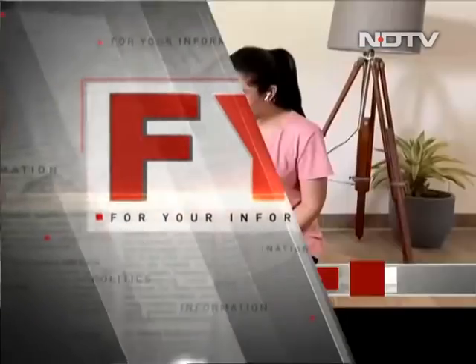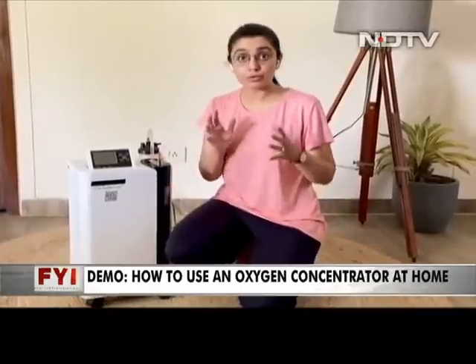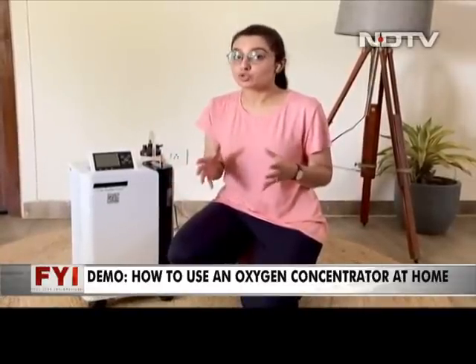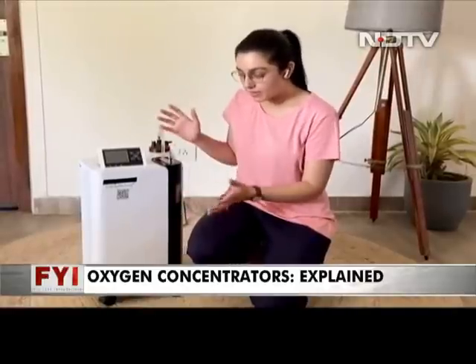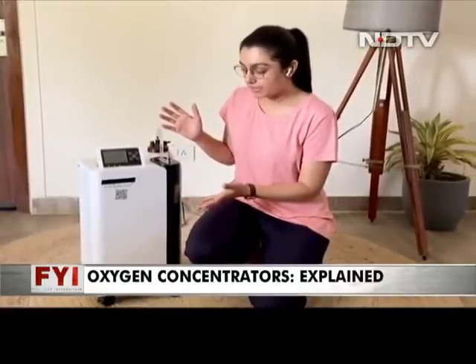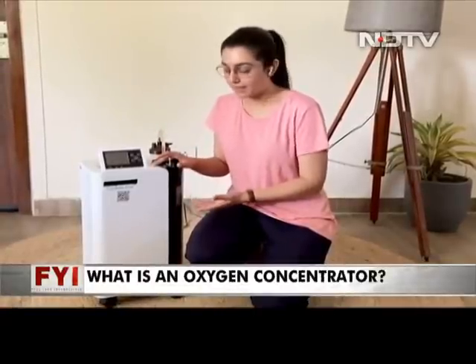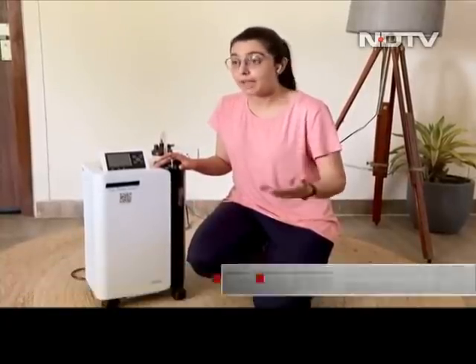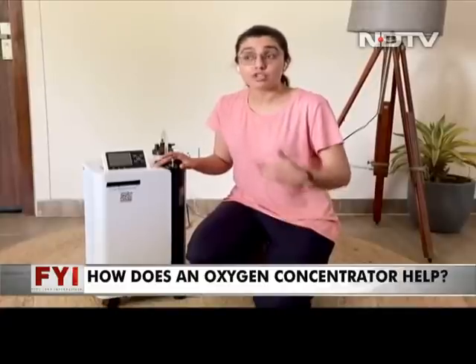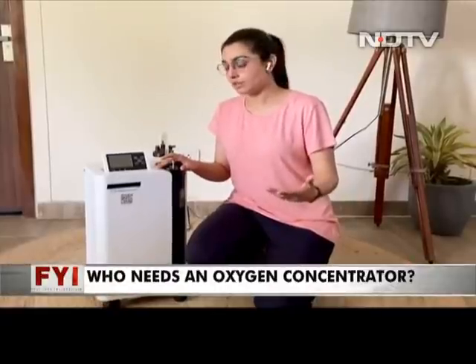So oxygen concentrators, everybody's talking about it, trying to get their hands on it, but even when you do, there is a particular way in which you should be using it. So I thought we'll do a quick demo for you to understand this in greater detail. So what I have over here is a very typical oxygen concentrator with a capacity of 5 liters. Now I have elderly people at home who've been using this for a while, so I'm just using this one for a demo. What you need will entirely depend on which category of patient it is, so let your doctor decide really which concentrator you need.